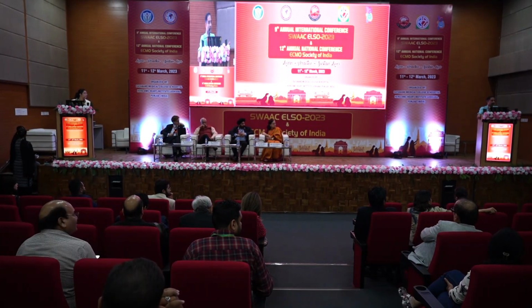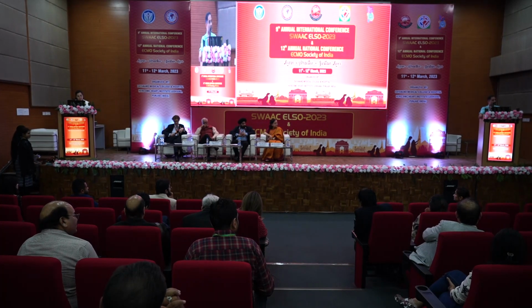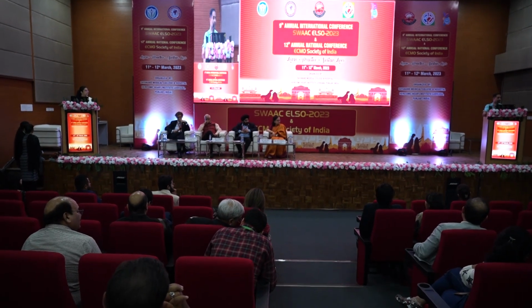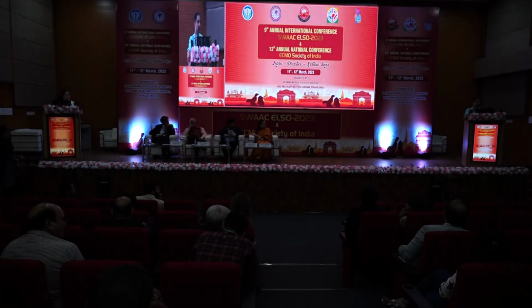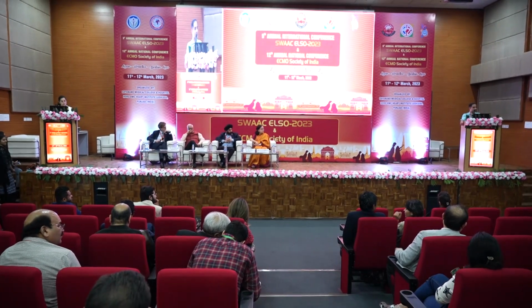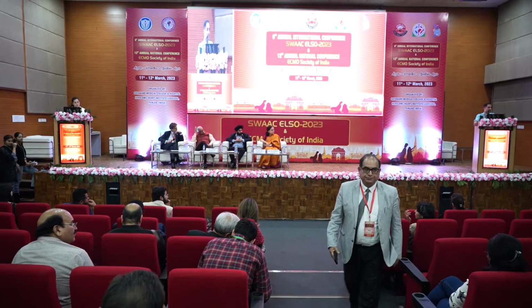When you decide to prone, again, as we spoke, would depend on if you have enough suggestion clinically to say that there is still a lot of poor compliance after going on ECMO, maybe 3, 4, 5 days. You have stabilized, you have tried your diuresis, not getting better. You can probably think of proning, provided you have enough documentation to say that the lung bases are terribly silted or really having a bad consolidation. Because to reach up to that level, probably the only option would be to prone. So on a given patient, yes, it may help. Now, I don't know whether data is going to come in the next 3 years, but if you look at specific individual scenarios, as we spoke, it may have some role to reduce the time duration.